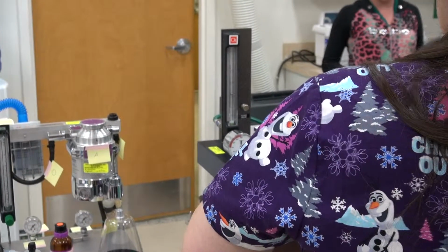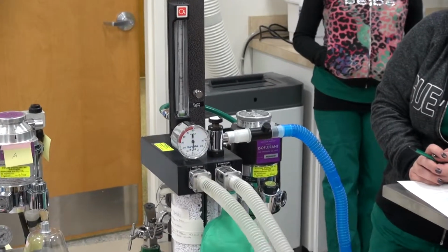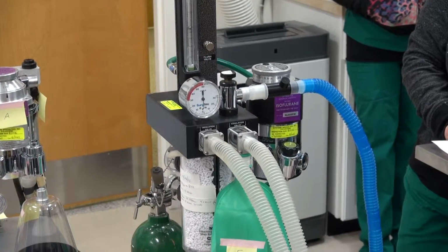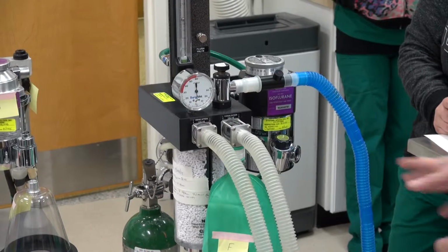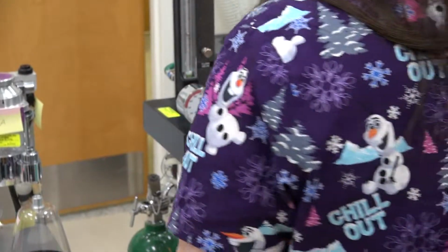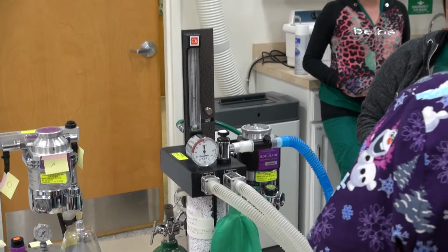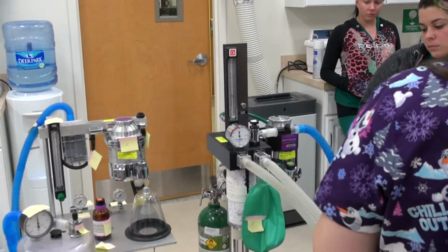As soon as I let this go, you're going to start to see my bag's going to start to go down. The flow meter's not really going down too much, but my bag will go down. It started to bobble a little bit there, but that's how you can tell if you have a leak in the system. It's not going to hold pressure in your bag. There's going to be a leak somewhere, okay? So you always want to check that before you start.